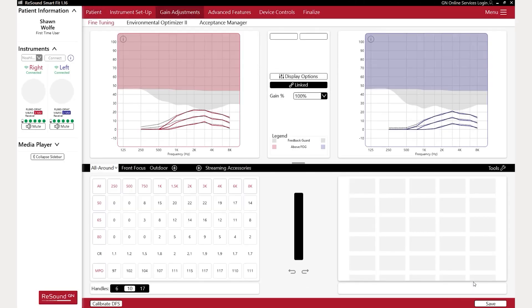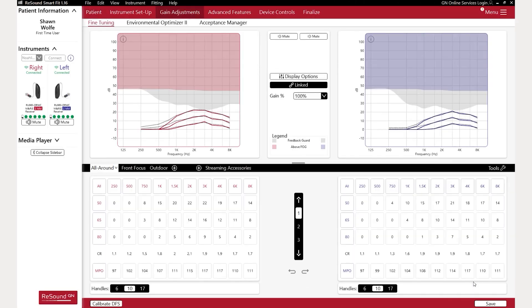Once the connection flow is completed, the hearing aids will be visible in the left sidebar. After the calibration, the fitting can be set on the patient's screen with choices for fitting rule, user experience level, and gain percentage. The gain adjustments and advanced feature screens can be used to further customize the fitting.